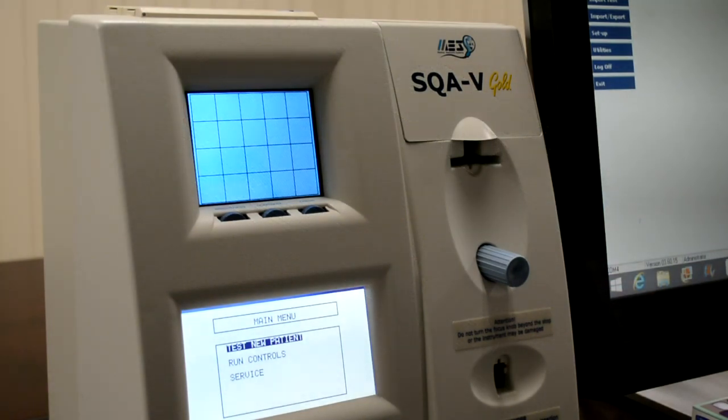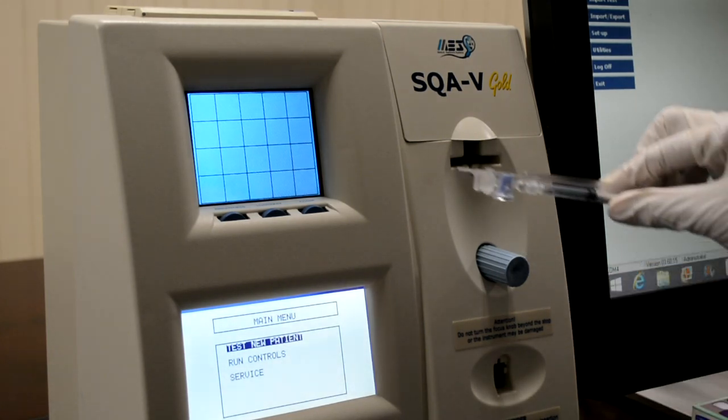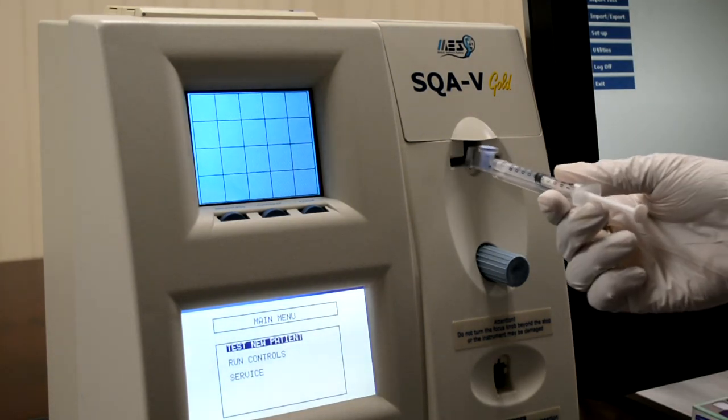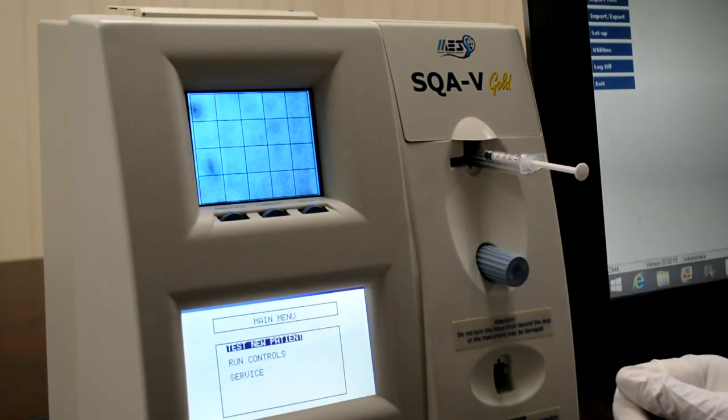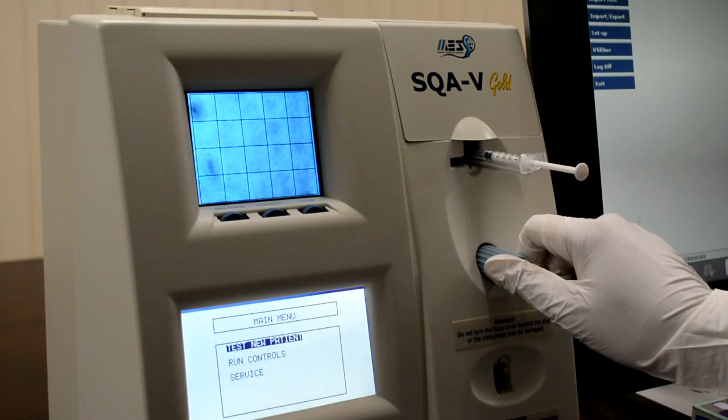To view samples in the SQAV testing capillary, insert it into the upper visualization chamber with the blue stopper facing up. You'll now adjust the blue focus knob in order to find a clear field of view.